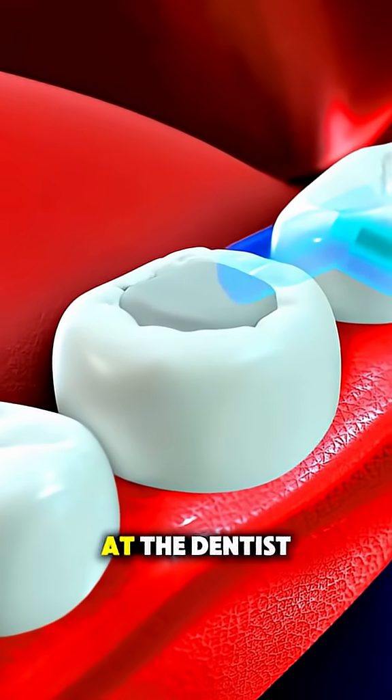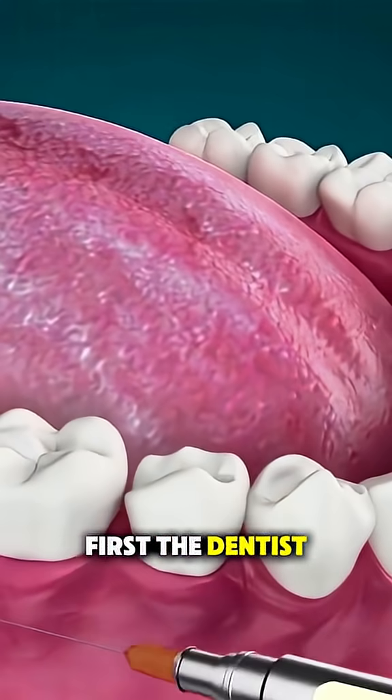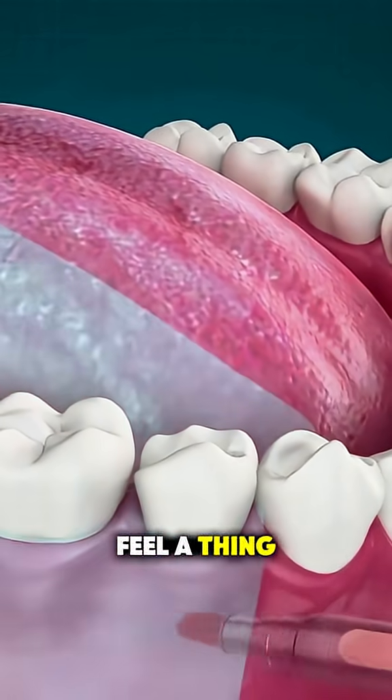Ever wonder how a composite filling is done at the dentist? It's actually pretty cool. First, the dentist numbs the area around the tooth so you don't feel a thing.